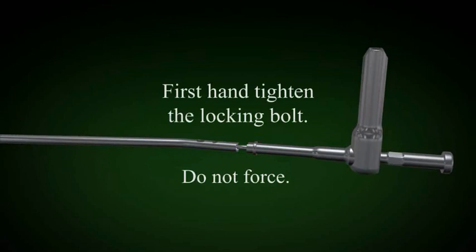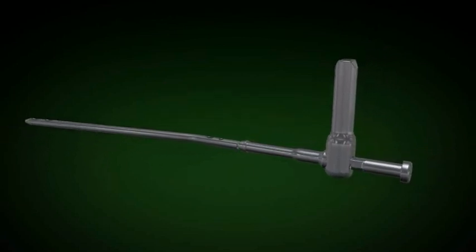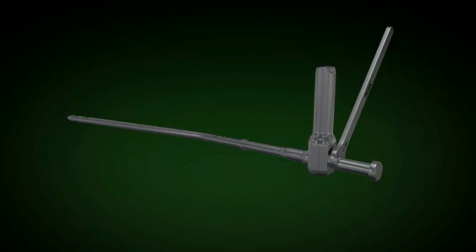In each approach using the Sign nail, the orientation of the proximal bend of the nail is different. Tighten the locking bolt using the wrench and check this periodically throughout insertion of the nail.